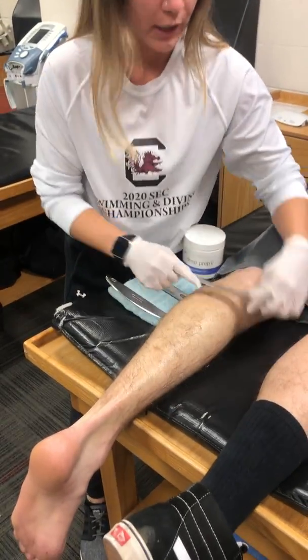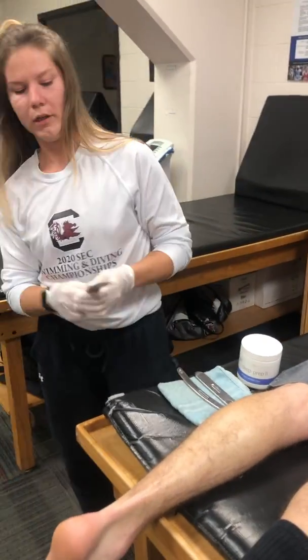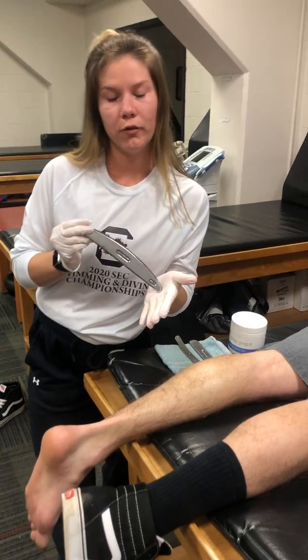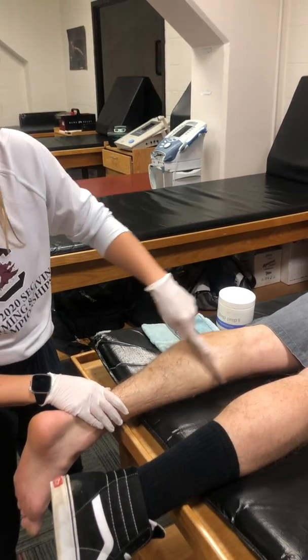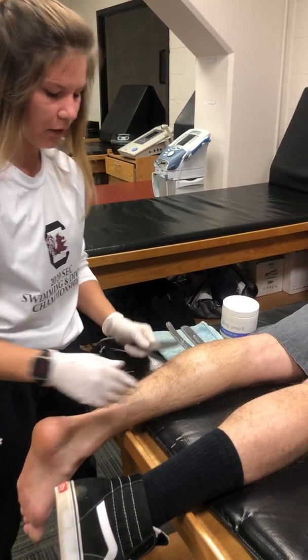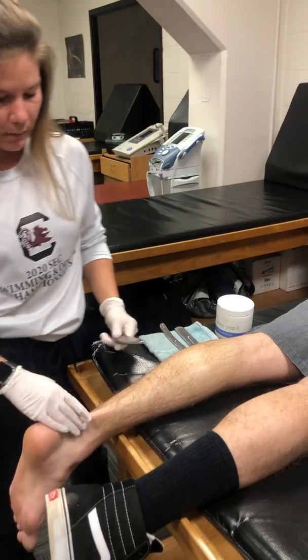I do this for two to three minutes, or at least until the area is warmed up. I then generally go to the GT4. This one is more convex, leading to extra pressure and more intensity. I make sure to work all the way down distally to the Achilles tendon.